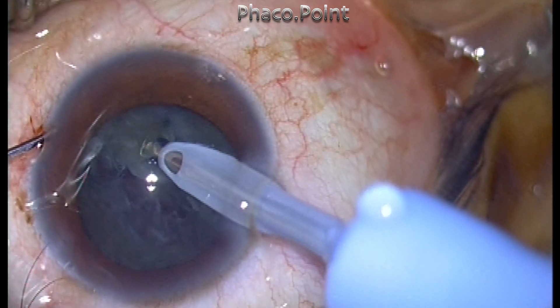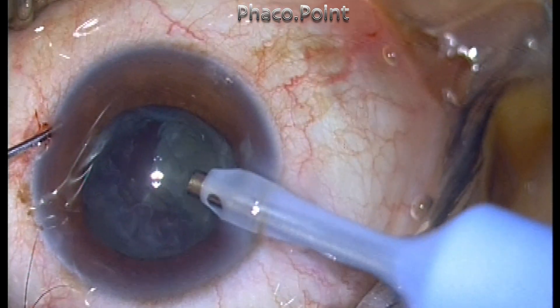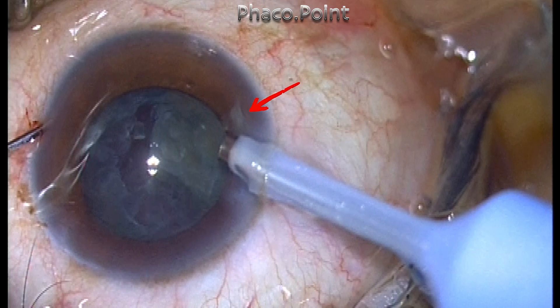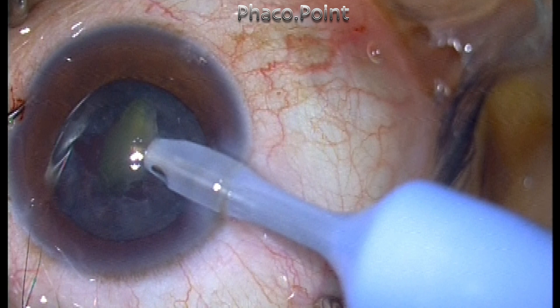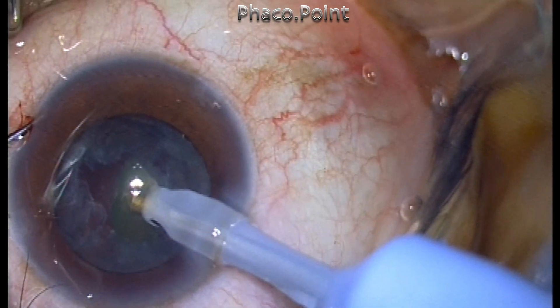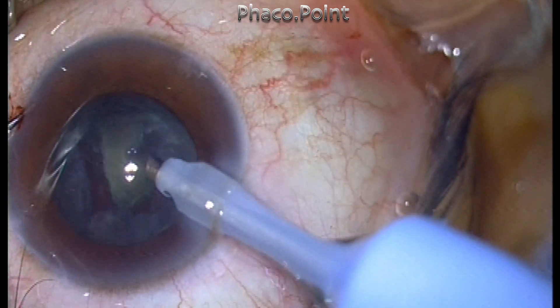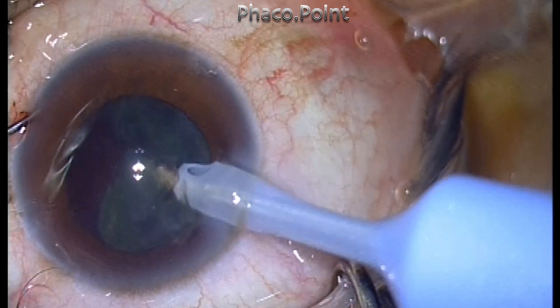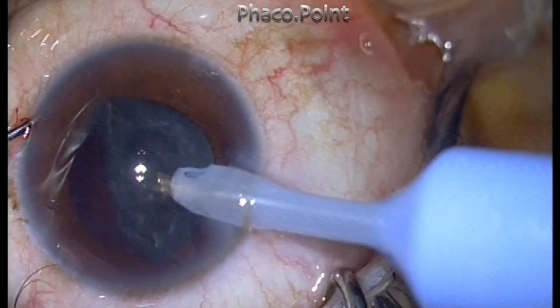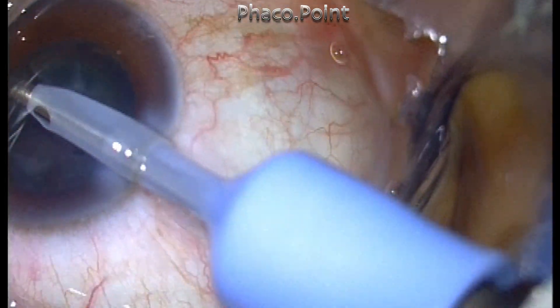I stabilized the eye with the corneal pocket incision using a rod pushed into a tangential opening. There's a small fragment close to the incision — I pull back the phaco tip and the irrigation sweeps it onwards and brings it to the center. In most phaco machines available today, the fluidics issues out from the sides of the irrigation port in the phaco tip. This sweep and the aspiration flow rate along with the vacuum generated will sweep the piece automatically towards the phaco tip, in a convection current fashion, propelling not only the nucleus fragments but also the epinucleus shell into the center onto the front of the phaco tip, after which it is aspirated.